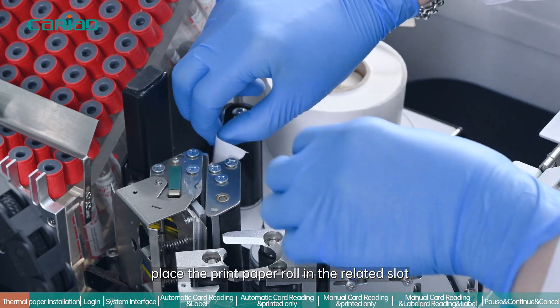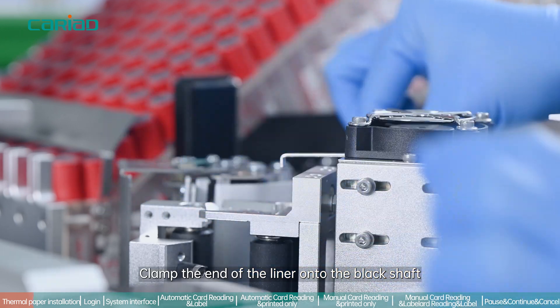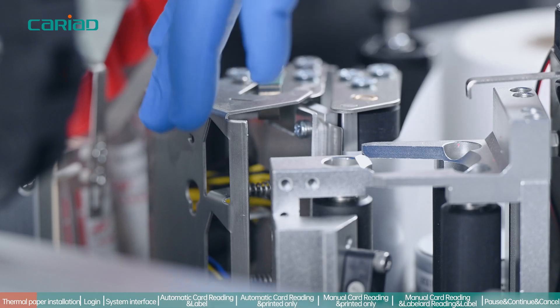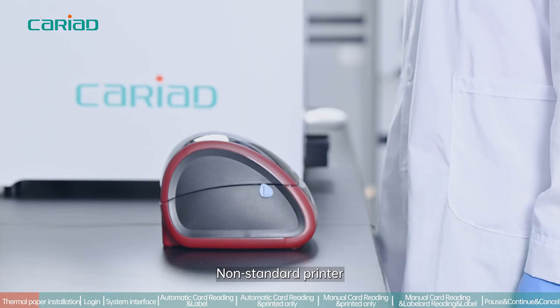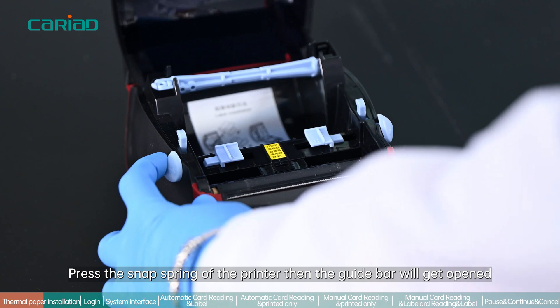Place the print paper roll in the related slot, pass the liner under the printer head, and clamp the end of the liner onto the black shaft.